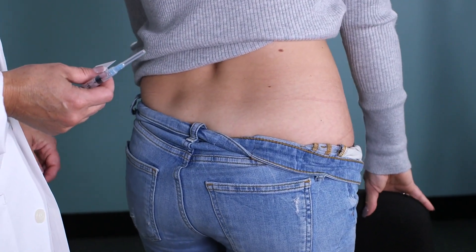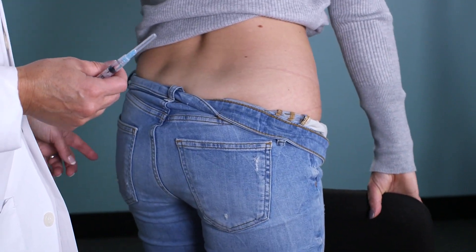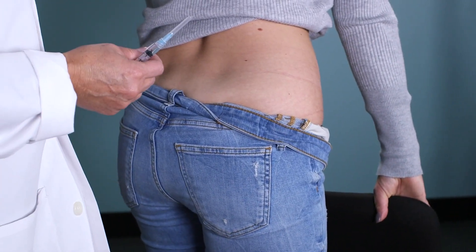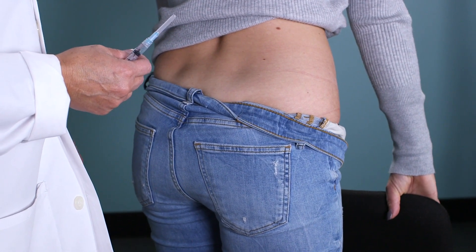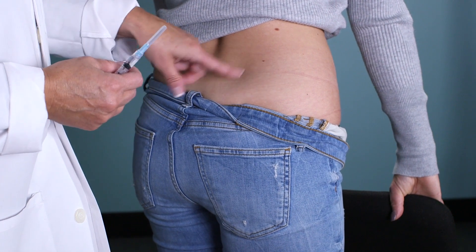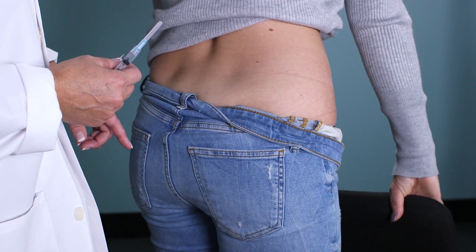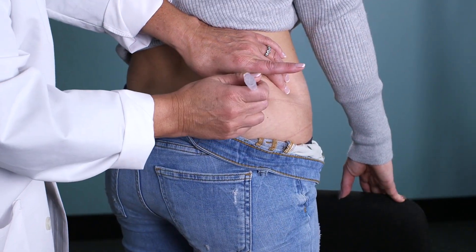Lean over and put your pressure on the non-injection side leg. Wiggle your toes on the side that you're getting the injection — that will allow you to keep the muscles on the backside loose. This injection is done in the upper outer quadrant of the buttock area.